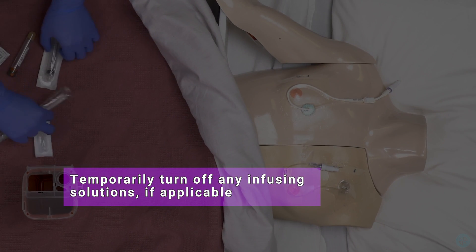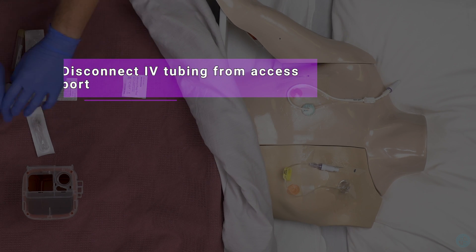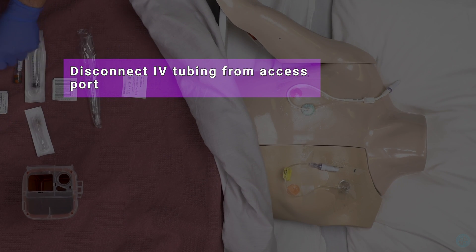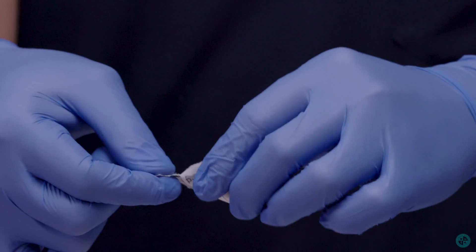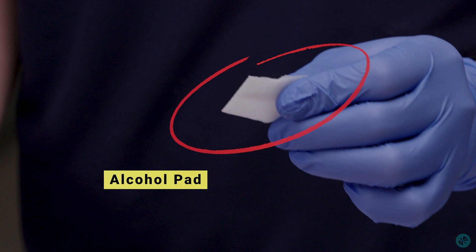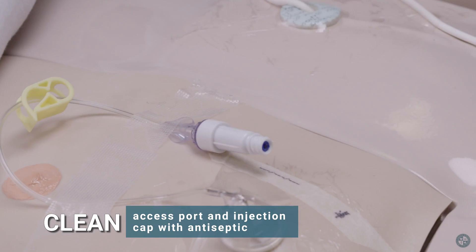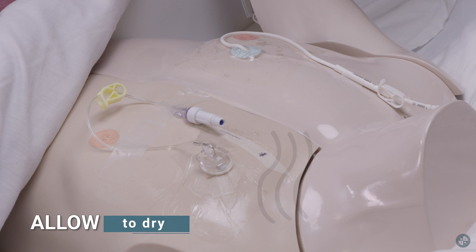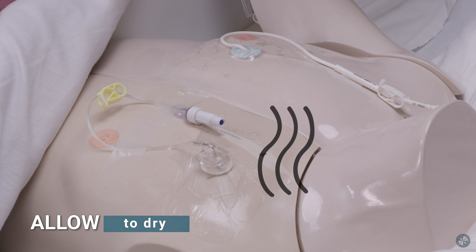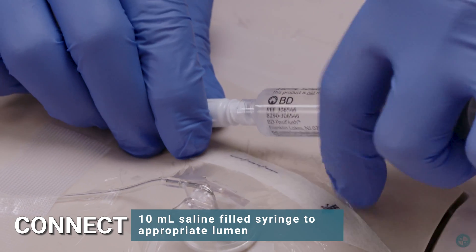Temporarily turn off any infusing solutions if applicable. Disconnect IV tubing from access port. Clean access port and injection cap with antiseptic and allow to dry. Connect a 10 milliliter normal saline filled syringe to the appropriate lumen.